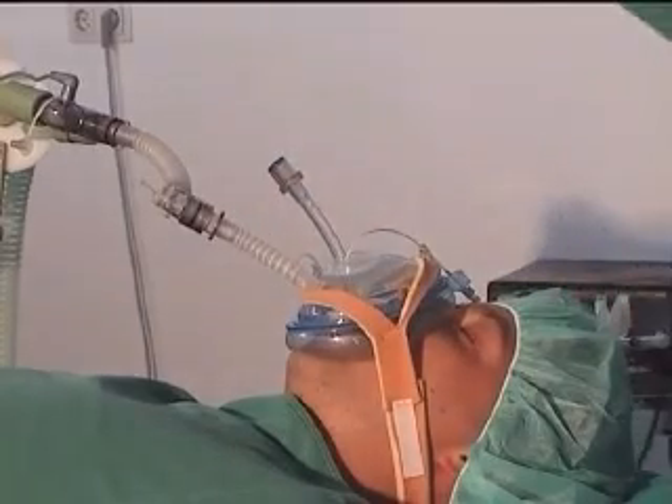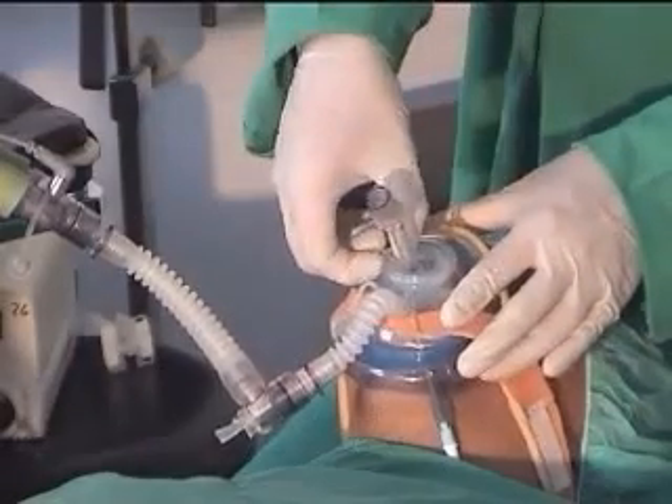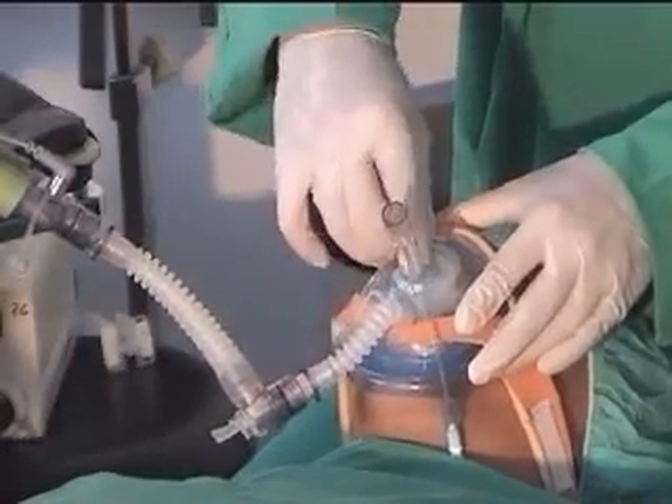Remove the fiber bronchoscope and push the membrane inside, which allows removal of the mask over the endotracheal tube with connector.